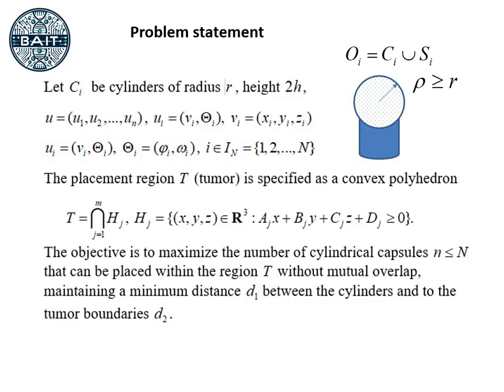By adjusting the spatial relationship between capsules and their source zones, planners can fine-tune dose gradients and enforce angular dispersion constraints. The spherical components define a localized region of radiation influence, allowing for precise control over capsule proximity and minimizing dose overlap. Our composite geometric modeling framework allows flexible capsule orientations and avoids strict parallelism. This enables more adaptive and anatomically conformal placement strategies.